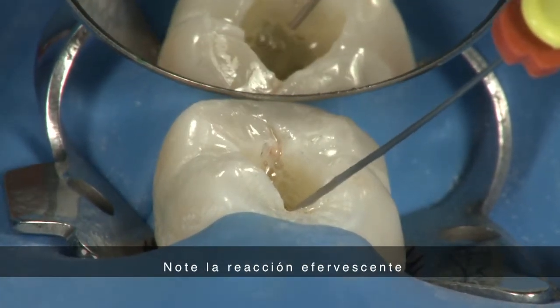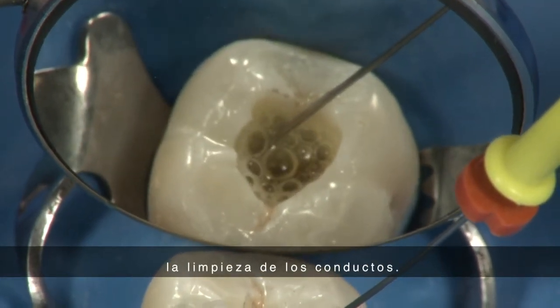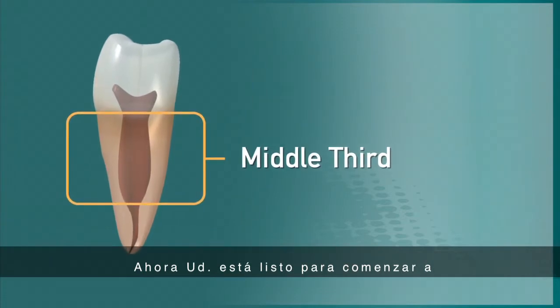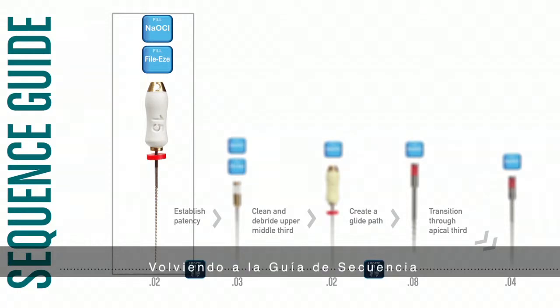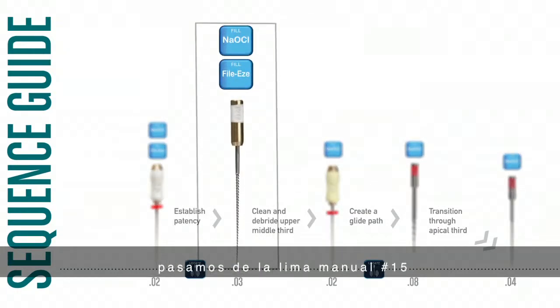Notice the effervescent reaction when the File-Eze mixes with the sodium hypochlorite. This aids in the cleaning of the canals. You are now ready to begin instrumentation of the middle third of the canal. Referring back to the sequence guide, we move from the number 15 hand file to the number 2 shaping file.